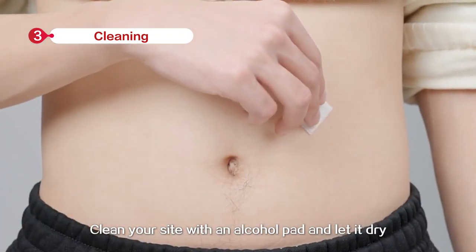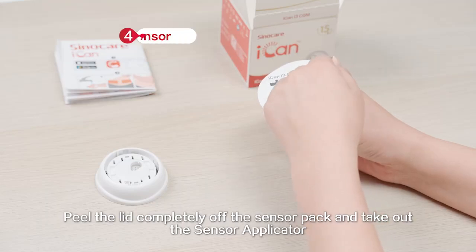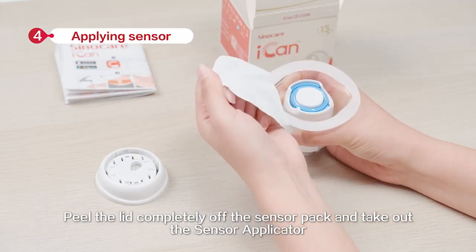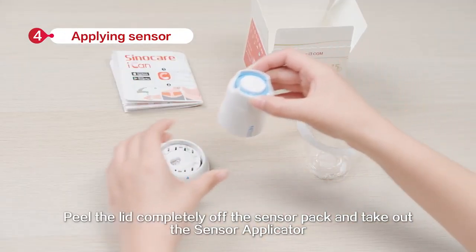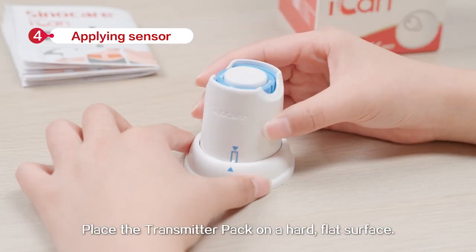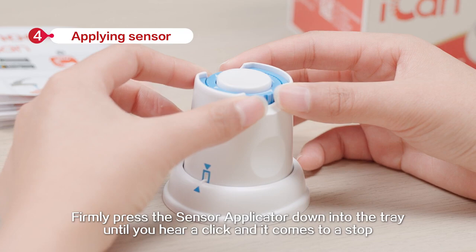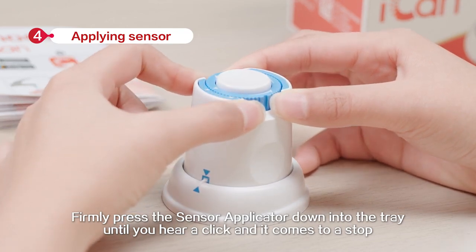Clean your site with an alcohol pad and let it dry. Peel the lid completely off the sensor pack and take out the sensor applicator. Place the transmitter pack on a hard, flat surface. Line up the blue mark on the sensor applicator with the mark on the transmitter tray.